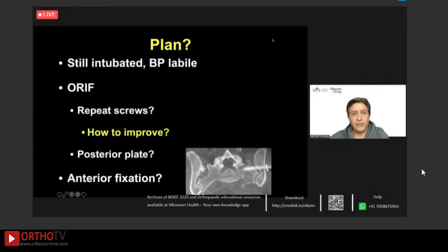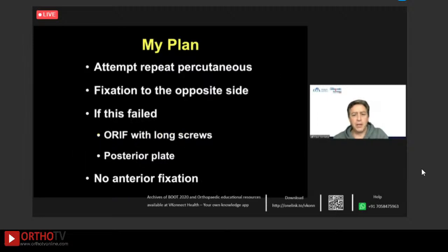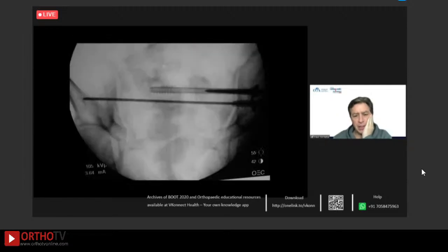My thought was, if I either couldn't reduce it well or the tract was pretty poor, I'd take the screws out, flip her prone and do an open reduction as Dr. Tricca said. So I had both things in my head and I was hoping for the best and expecting the worst. I usually get the worst, but that's what we were hoping for. Here you can see the reduction again as it comes into traction. This was my attempt. If that failed, I was going to go with a posterior plate and screws, and not add anterior fixation if I did that. So we were lucky.